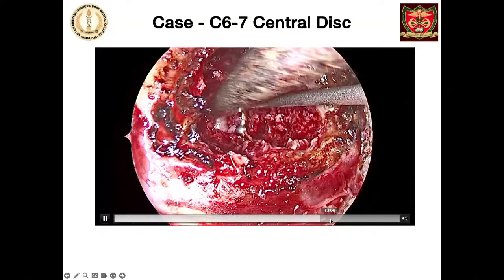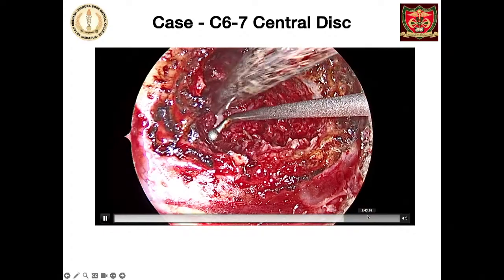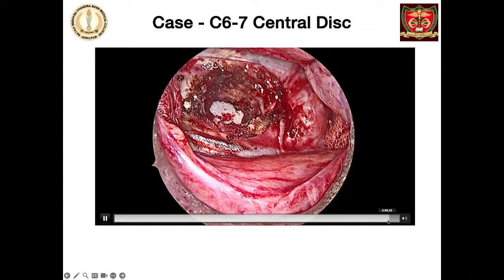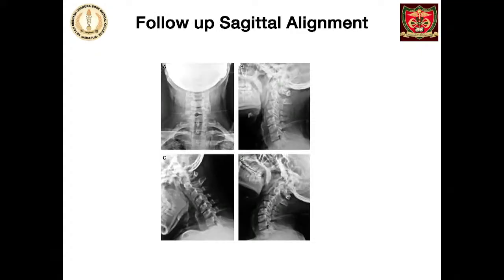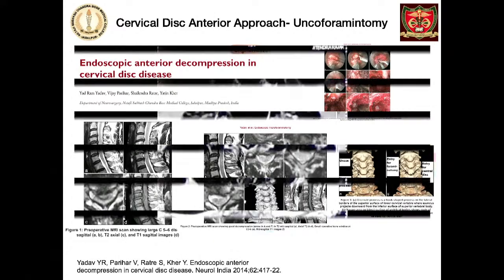Sorry. And then opening the PLL and taking out the, and further removal of PLL and assessing the decompression with the blunt dissector. And this was the area which we have worked on, the rest of the disc has been preserved.